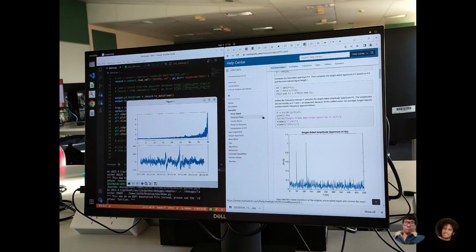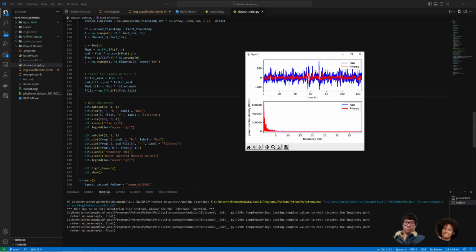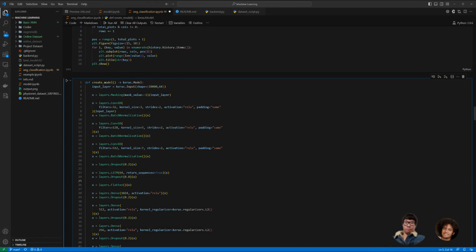For our software stack, the code base for the signal processing layer is being developed, while the deep learning model is currently being trained and fine-tuned on open source datasets. We have simulated real-time data and are working on a performant way of extracting useful features through various digital signal processing techniques. We've also been trying out different hybrid deep learning model architectures due to the performance uplift compared to single model architectures and been optimizing their hyperparameters.